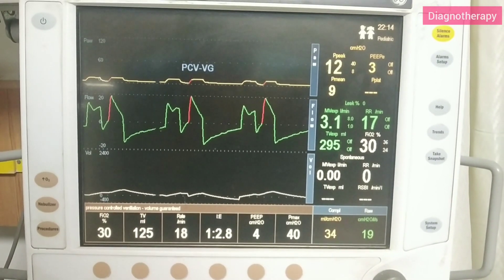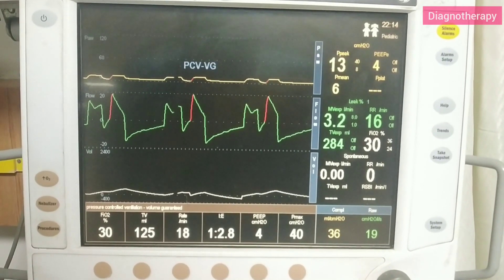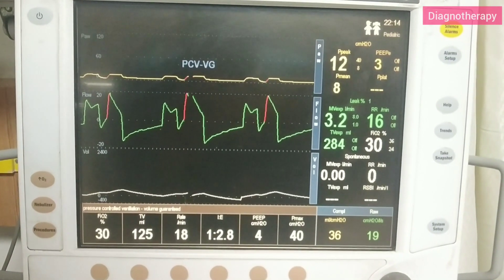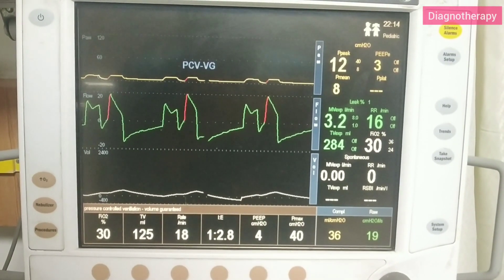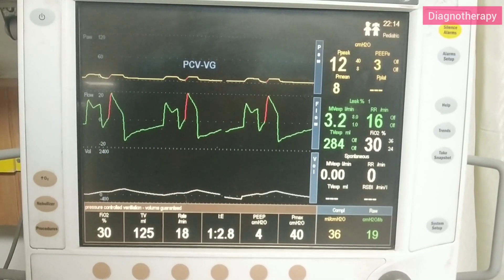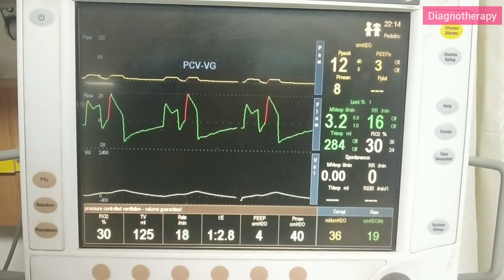Here we can see all the settings and all the parameters that have been set for the patient.